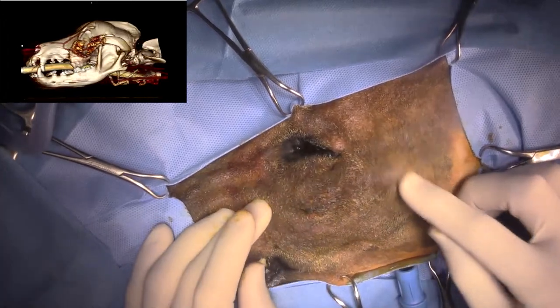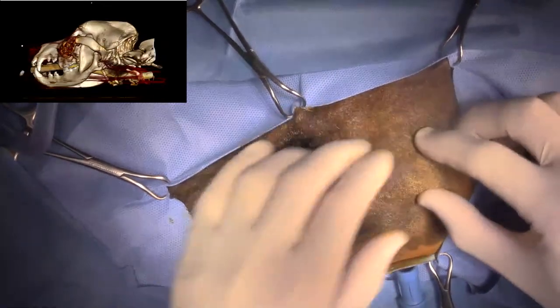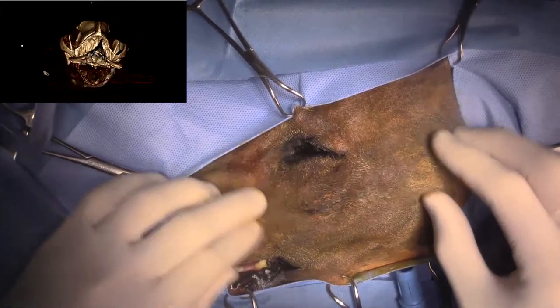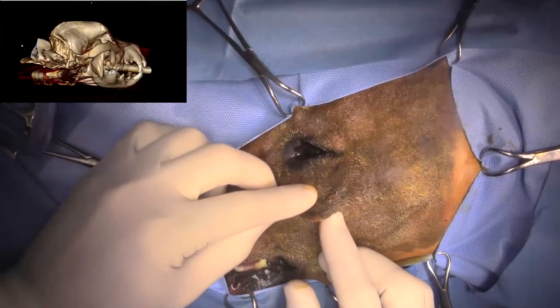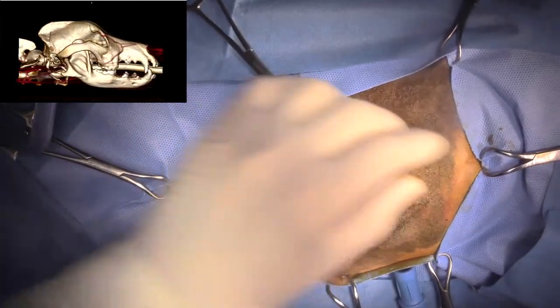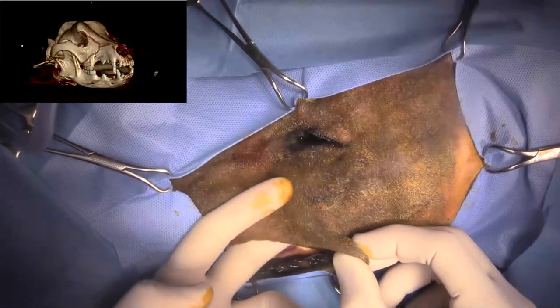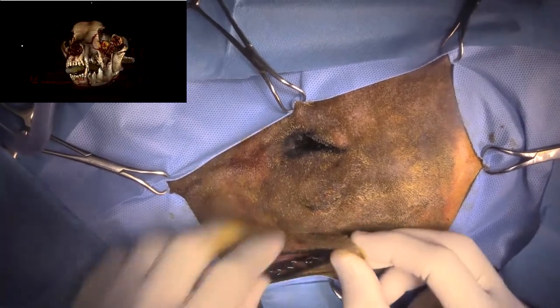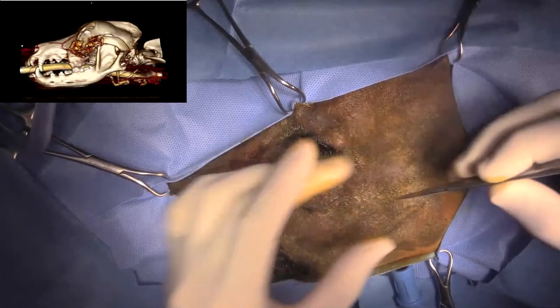So the mass extends all the way back to here on the zygomatic arch, and so we're going to have to go quite a bit caudal to it because, as we know, facial fibrosarcomas tend to be quite invasive, have a high chance of local recurrence. So we've got a biopsy scar right here that I need to make sure that I exclude with my incision, although we don't need to get a wide soft tissue margin otherwise. And then we have to figure out what we're going to do with the inside of the mouth here, and whether I'm going to take out this portion of the maxilla where the molar teeth are embedded.